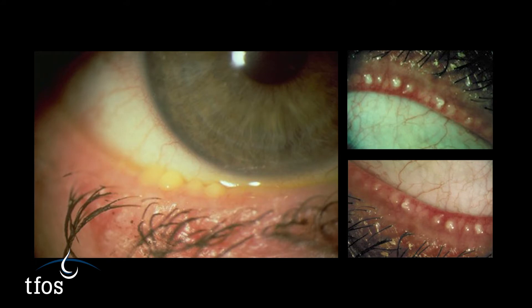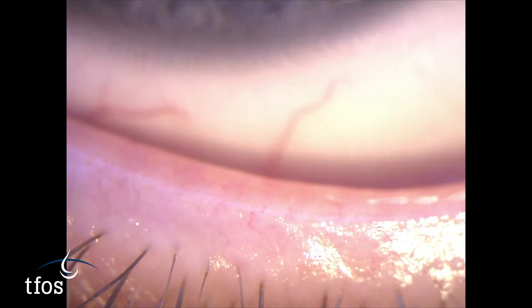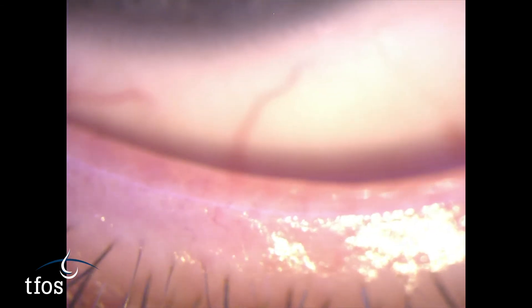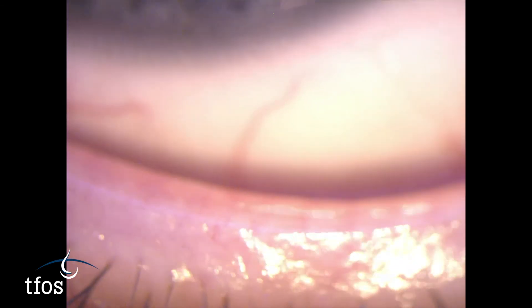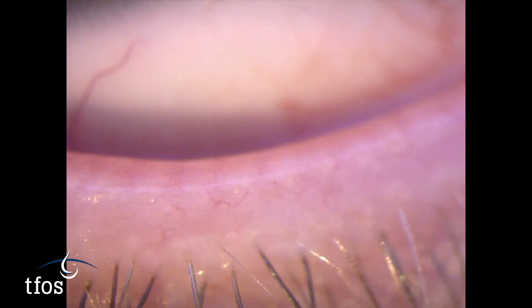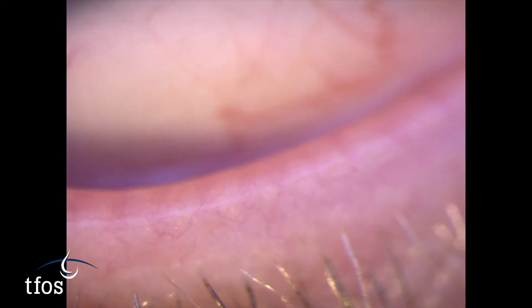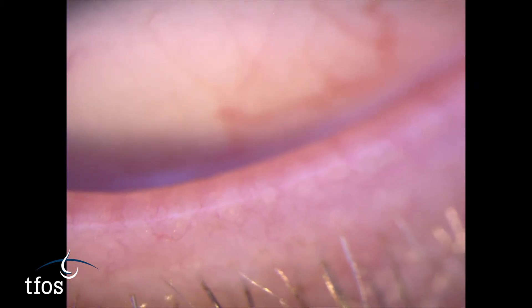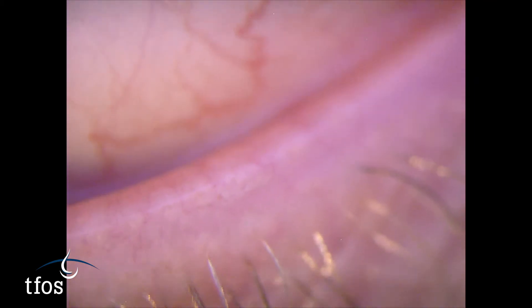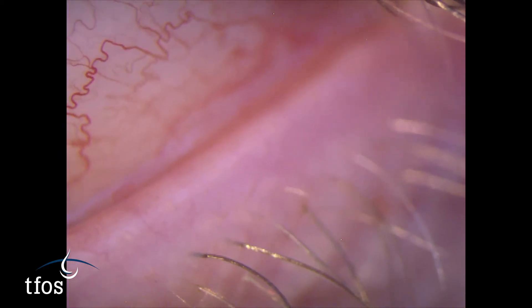The lid margin profile should be assessed for signs of hyperkeratinisation, best visualised with lissamine green. Telangiectasia, observed as thread-like vessels on the lid margin surface, should also be noted, as well as eyelashes for signs of anterior blepharitis, which commonly present with crusting.